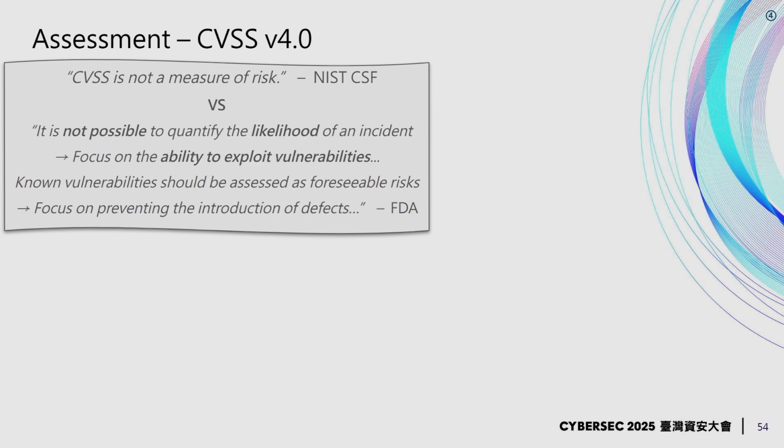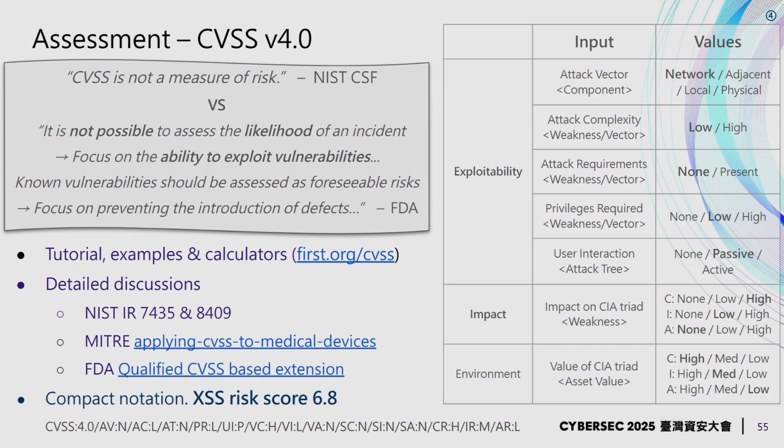focusing on vulnerability is the way to go, and explicitly qualifies the CVSS also later. And moreover, CVSS is widely discussed, widely supported. There's a plethora of resources out there. So it's making it the easiest method to justify, at least for software risk assessment.